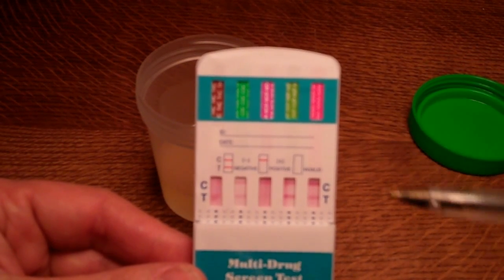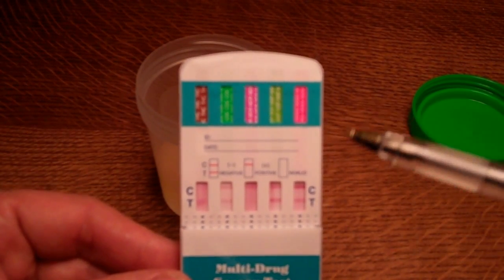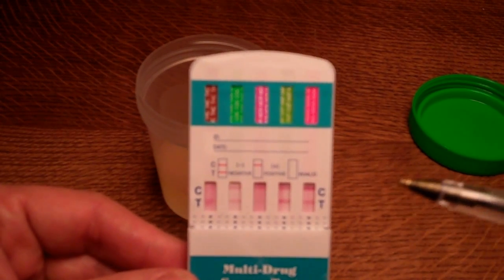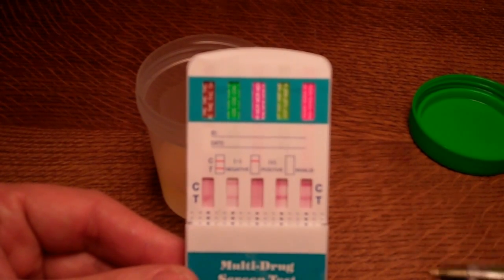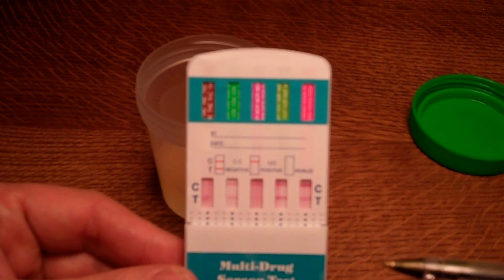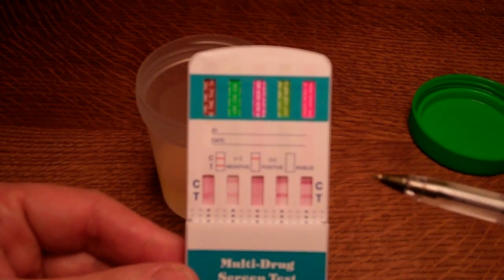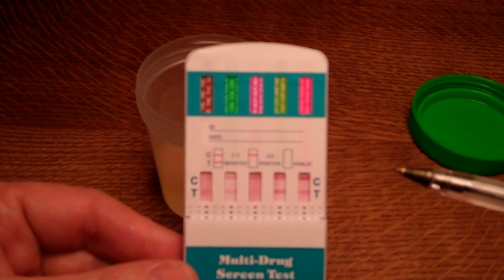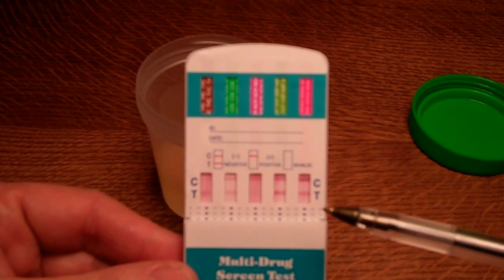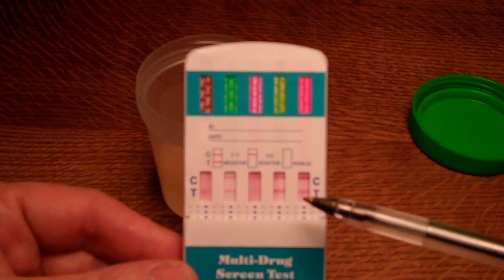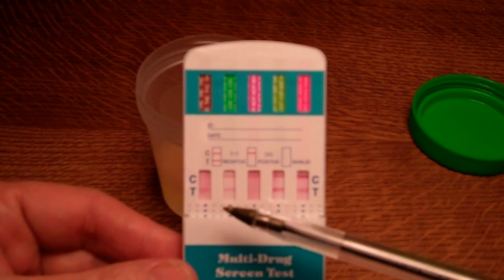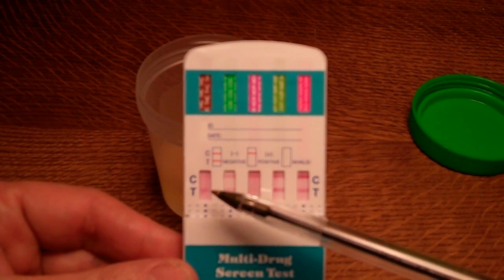What you're looking for is the presence of a test line forming in the presence of a control line. For a test to be interpretable, you must always have a control line developing, and what you're looking for is the presence or absence of a test line. A test line present indicates a negative result—there's no drug in the system or urine sample at above the cutoffs for the test in that case.